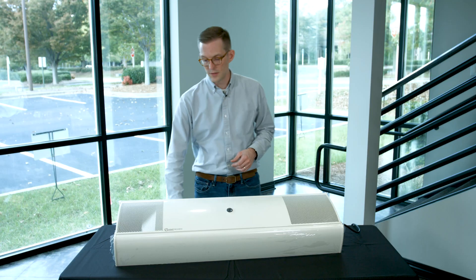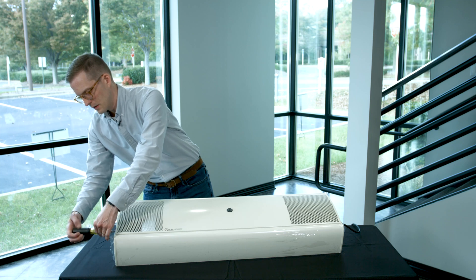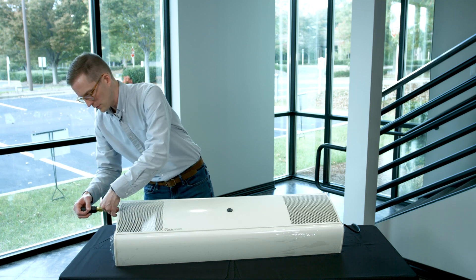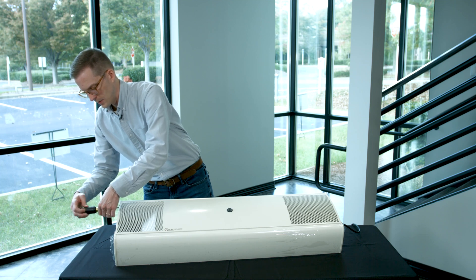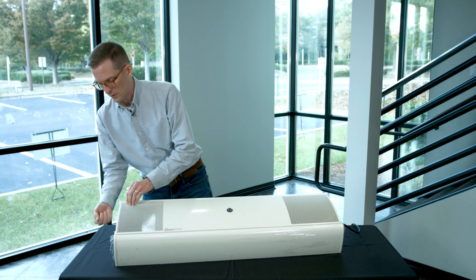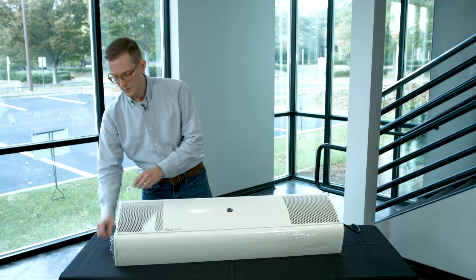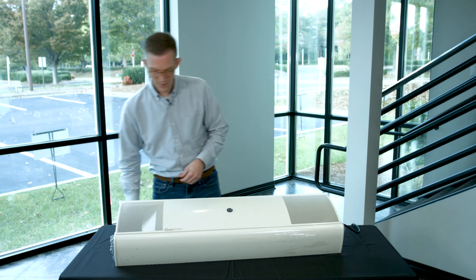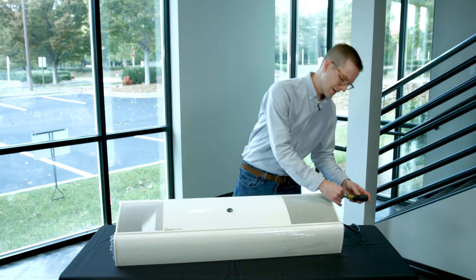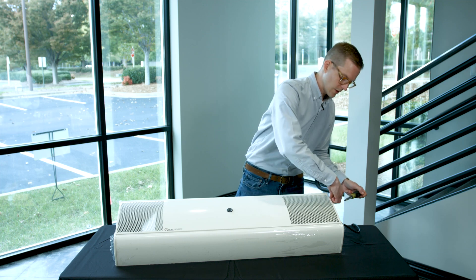The first thing we need to do is grab a Phillips head screwdriver and open the unit by unscrewing four screws on the side of the unit that hold this cover plate down. As I'm doing this, it's very important to remember that anytime you're removing the cover from this unit, you need to be very careful to ensure that the unit is powered off so there isn't any accidental exposure to harmful germicidal ultraviolet energy.